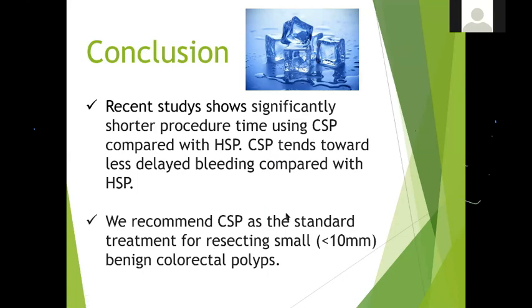When you detect a 10 millimeter lesion in the right colon, a possible candidate for cold snare, do you use the tools of diagnosis in sequence? White light first, of course. After that, NBI with high definition and optical magnifying image. And after that, indigo carmine and magnification, or do you prefer only one of those methods?